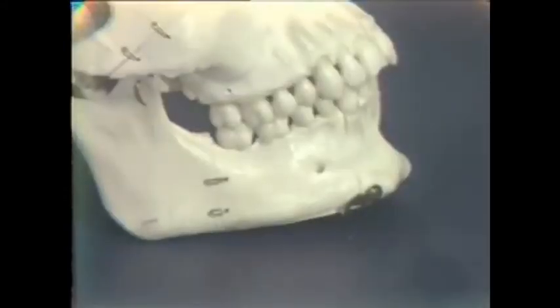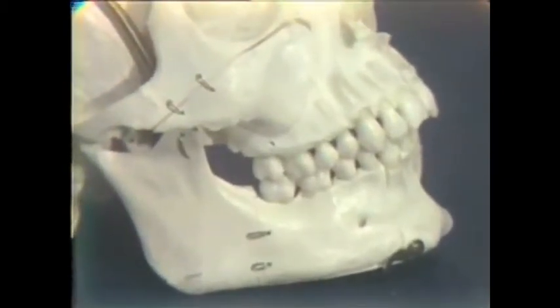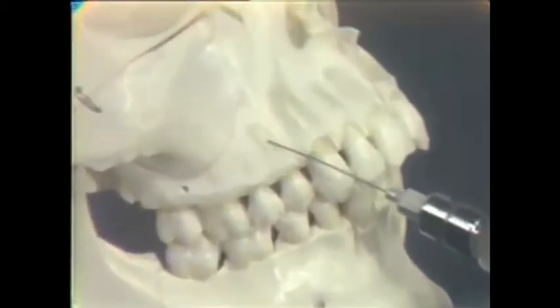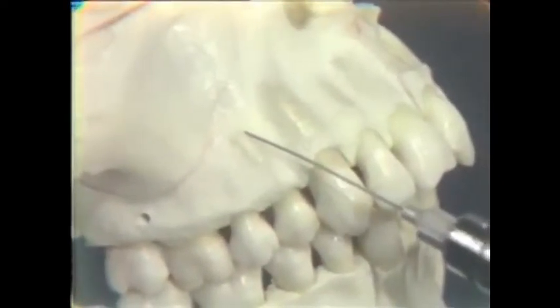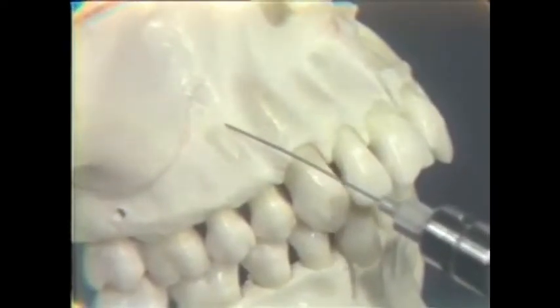The maxillary bicuspids are very simply infiltrated buccally, and remember again, we are anesthetizing the terminal branches of the middle superior alveolar nerve. Just as with the molar, with the mouth half closed, cheek retracted, and our needle bevel is directed towards the vestibule and quickly through the soft tissues, and then needle bevel engaging bone at a level of or slightly above the apex of the bicuspid, whether it be the first or the second bicuspid.